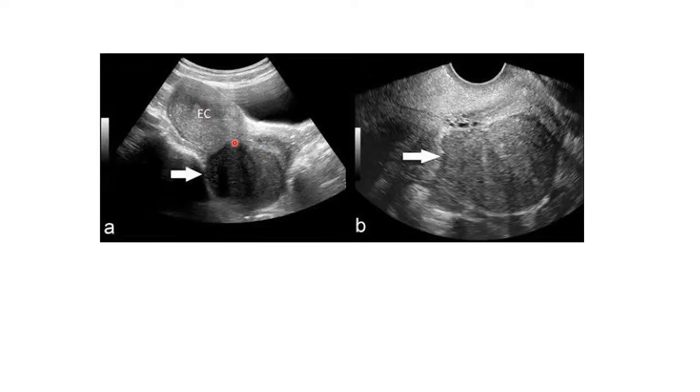So again here, look nicely, we do have a fibroid there, but the uterus is here. So somehow it's in contact with the uterus, but it might not be directly feeding off the uterus. Once this fibroid detaches itself or is no longer getting feeding from the uterus, it is now called a wandering fibroid, what we call a parasitic leiomyoma.